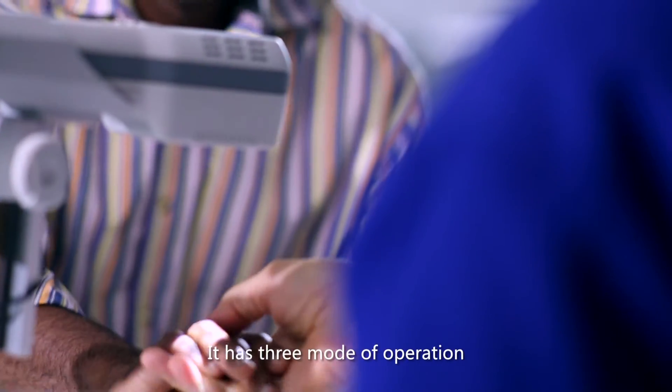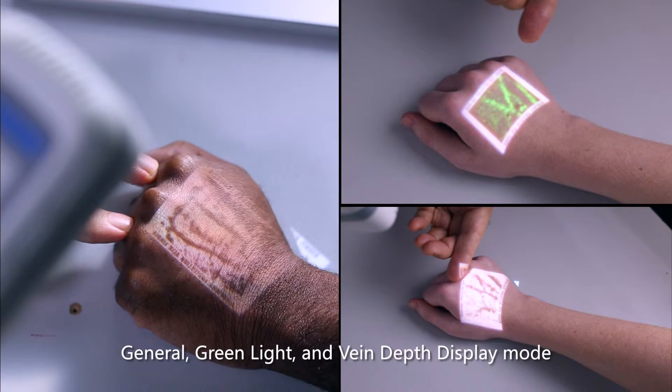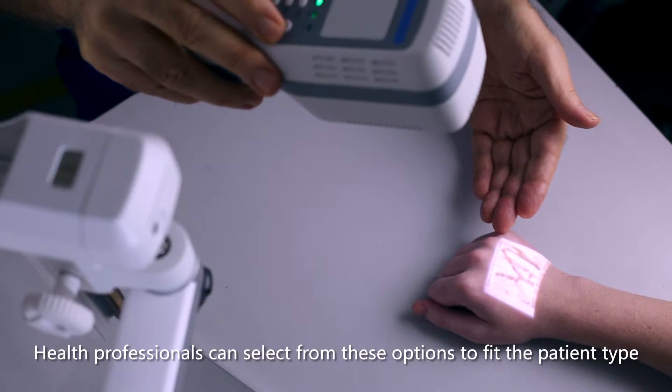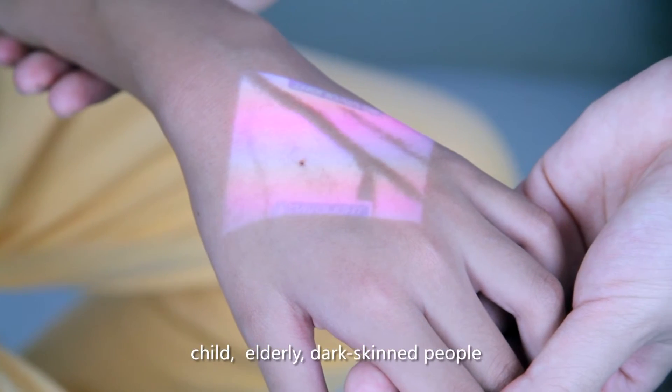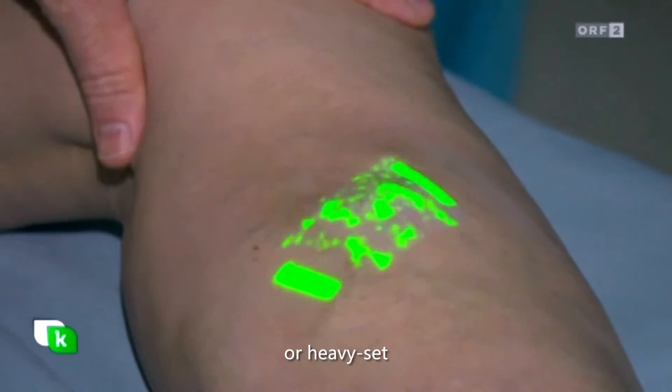It has three modes of operation: General, green light, and vein depth display mode. Health professionals can select from these options to suit the patient type: child, elderly, dark-skinned people, or heavyset.